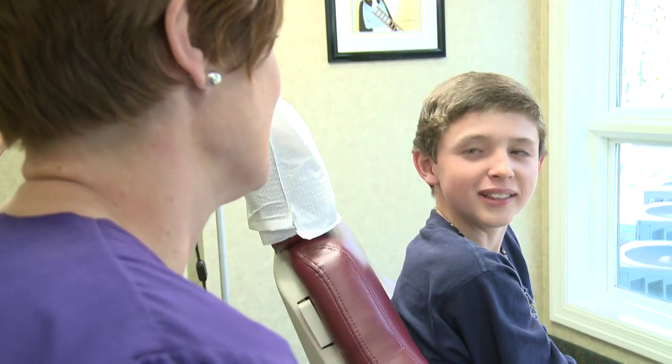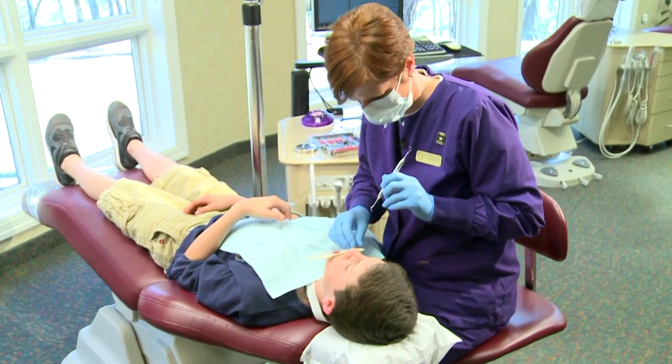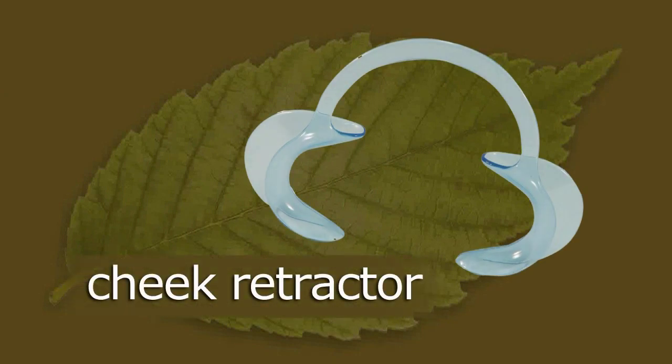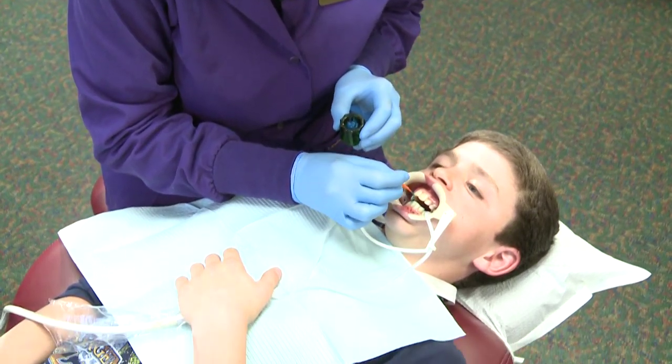We need your teeth to be really dry, so the first step is having the assistant place the cheek retractors. This plastic mouthpiece will keep your cheeks away from your teeth, which will prevent moisture from sneaking back onto your teeth. Once the retractors are in place, we will begin preparing your teeth.